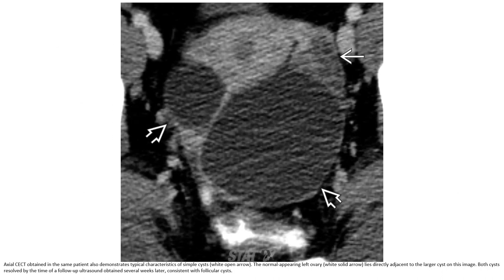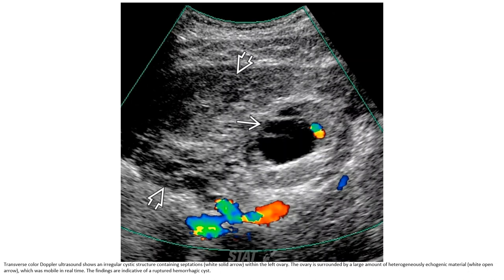CT obtained in the same patient also demonstrates typical characteristics of simple cysts. The normal right ovary lies directly adjacent to the right cyst on this image. Both cysts resolved by the time of follow-up ultrasound obtained several weeks later, consistent with follicular cysts.